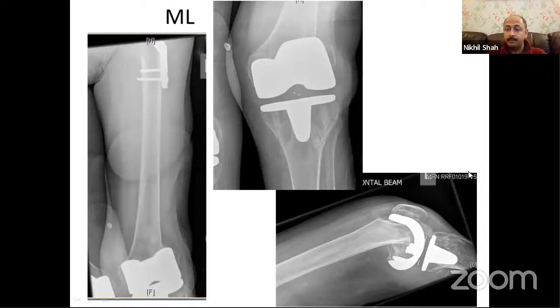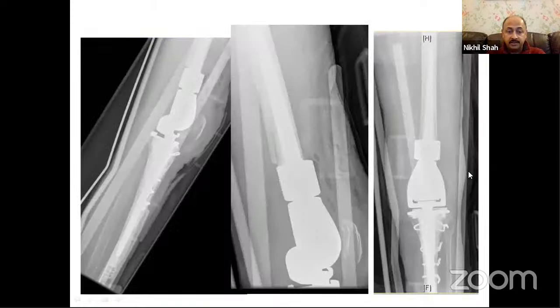So in this case, what I plan to do is a tibial tubercle osteotomy. It's not something that we do very often, but it is worth knowing the principles and the techniques of doing a TTO properly, using a step cut proximally, using a thick cortex, doing a very long TTO, and keeping your entire periosteal sleeve intact. This was a technique I learned in Canada from my mentor there, Dr. Hugh Cameron, when I was working there. And that is the technique I use.